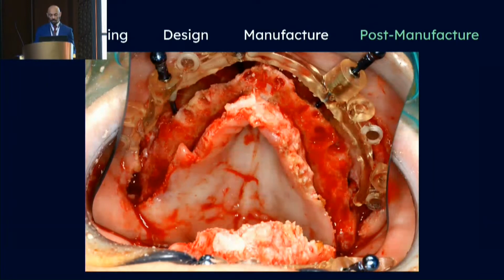Clinically speaking, the treatment was initiated with the extractions of the patient's dentition, and the maxillary bone reduction guide was fixated to the bone. This reduction was necessary to hide the margin of the final full arch hybrid above the patient's highly animated lip, if you remember from the beginning of the diagnostic phase.